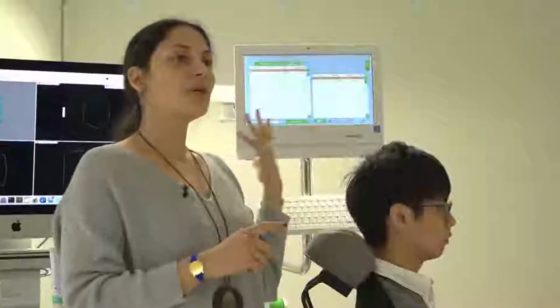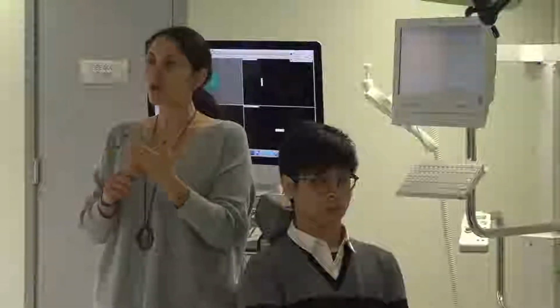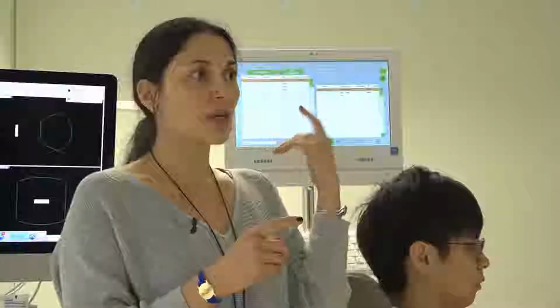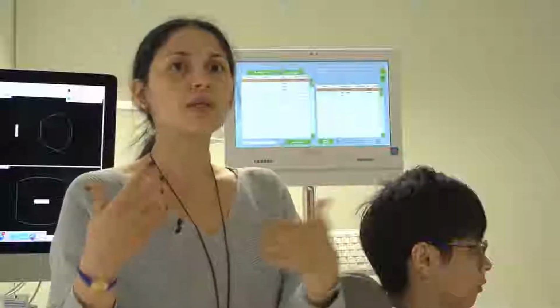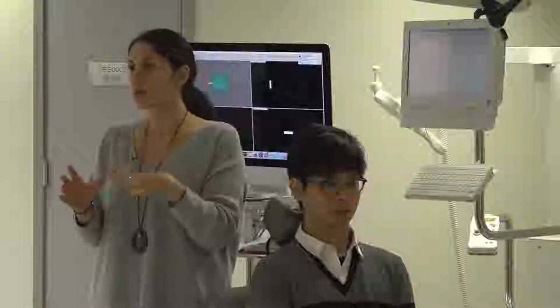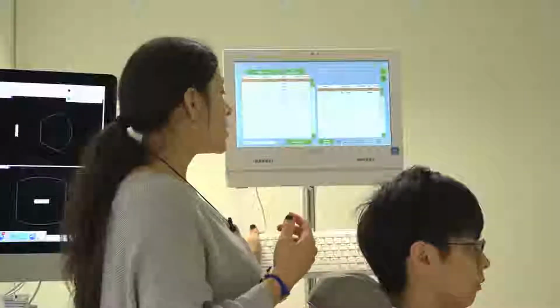I have already created the script for 1 Hertz, low frequency TMS. The other protocols you can do there are repetitive TMS, which you have ready, very common. Probably tomorrow we will do an example with 10 Hertz, so high frequency TMS, for you to know how to do it. It's very easy. The only thing you need to know is what you want to put there, and that's it. Obviously, when you don't know it, it's very difficult. So this is the equipment.